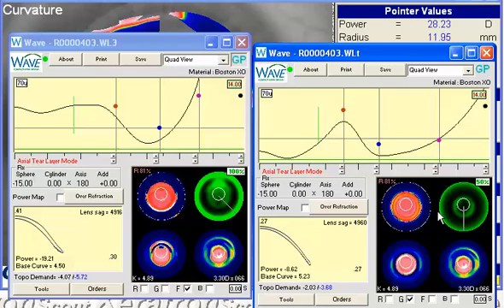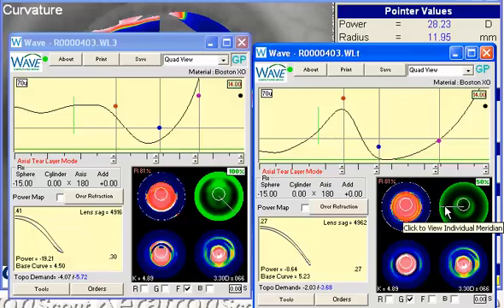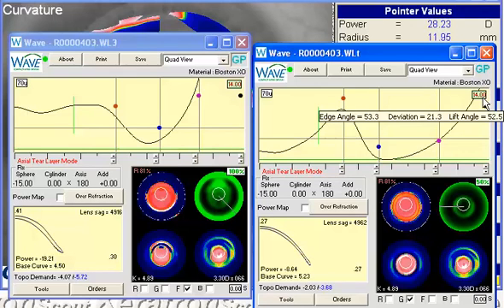Hopefully a little bit more stable result with that lens and less trapping the air bubbles. I think air bubbles aren't going to be inherent in this lens because you got such a central mountain peak, and it gets so flat out here, so you get this inherent gap in through here, so you have a little trouble with trapping bubbles. So in that case, if it still continues to be an issue, you may want to drop down to more like an on-cornea fit, maybe more like a 10.0, depending how small your other lens was. Maybe go a little larger than that, keeping it in the cornea, and that may give you a little better chance of matching these areas.